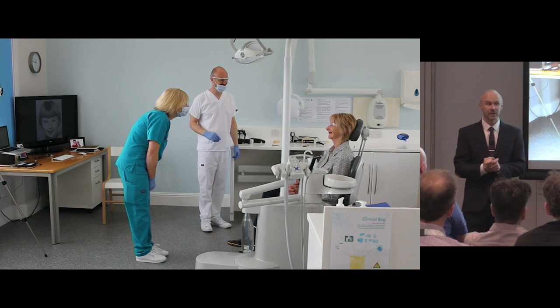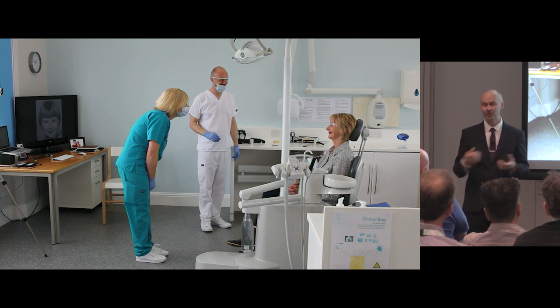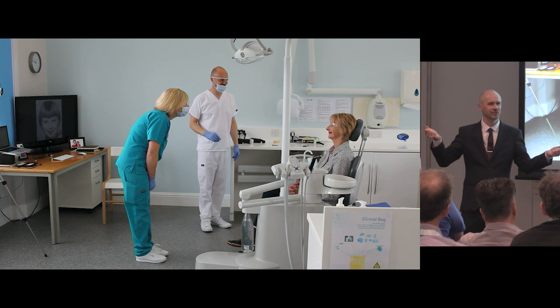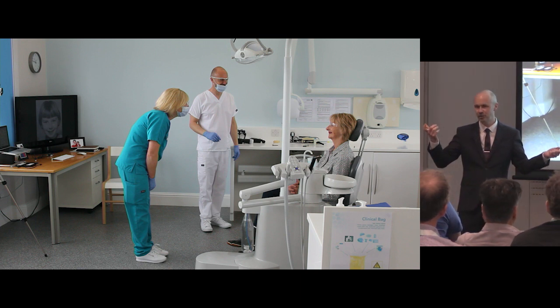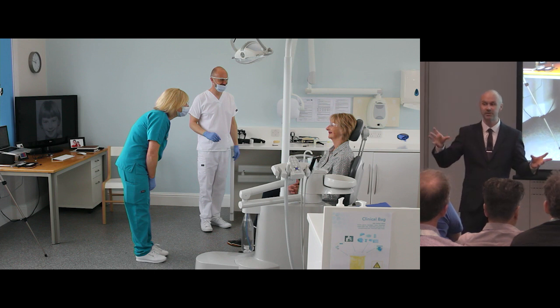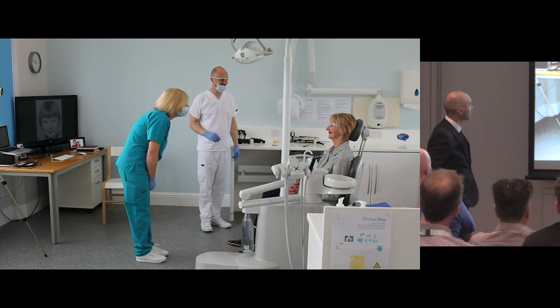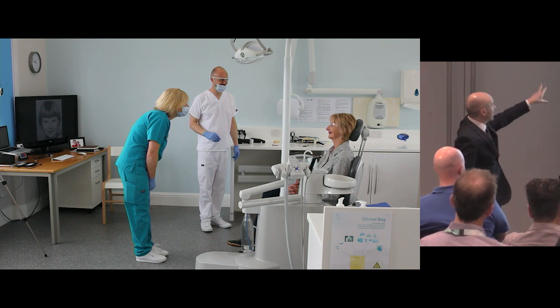Interestingly, I don't get the patient to participate at all with this. They just sit there, because I don't get them to look in the mirror. If they smile, they're just going to see a lump of red wax, and it's completely not useful. It's really important they participate at the try-in, when we've got the teeth on. So we're looking at that there.